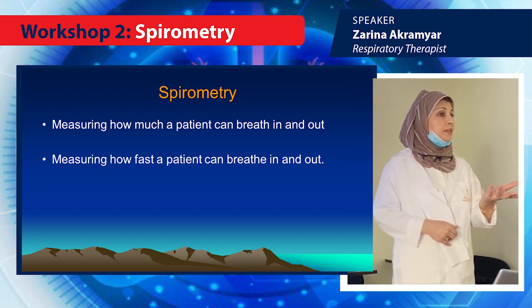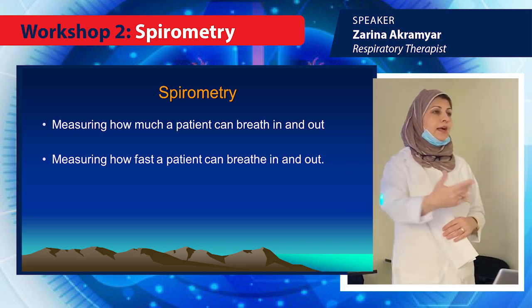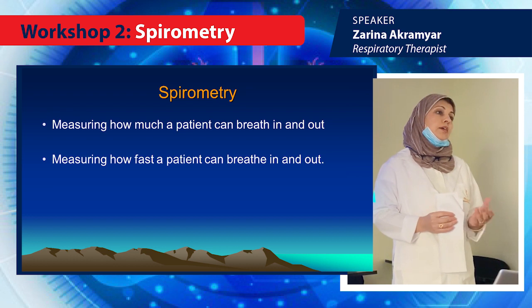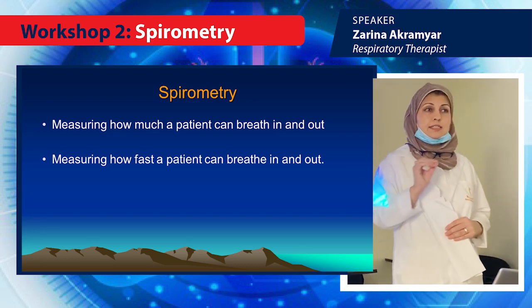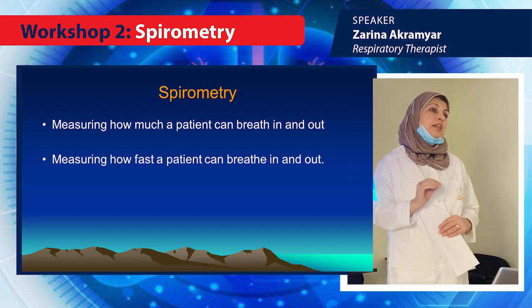most effective treatment? You start the medication, and 2 months later you ask them to come back and you do another spirometry, and you see the difference. How much improvement. This also we can do. So it's a lot of questions to be answered by just a simple blowing test. But I say simple, but it's not that simple. As long as you know how to do it, it's simple.